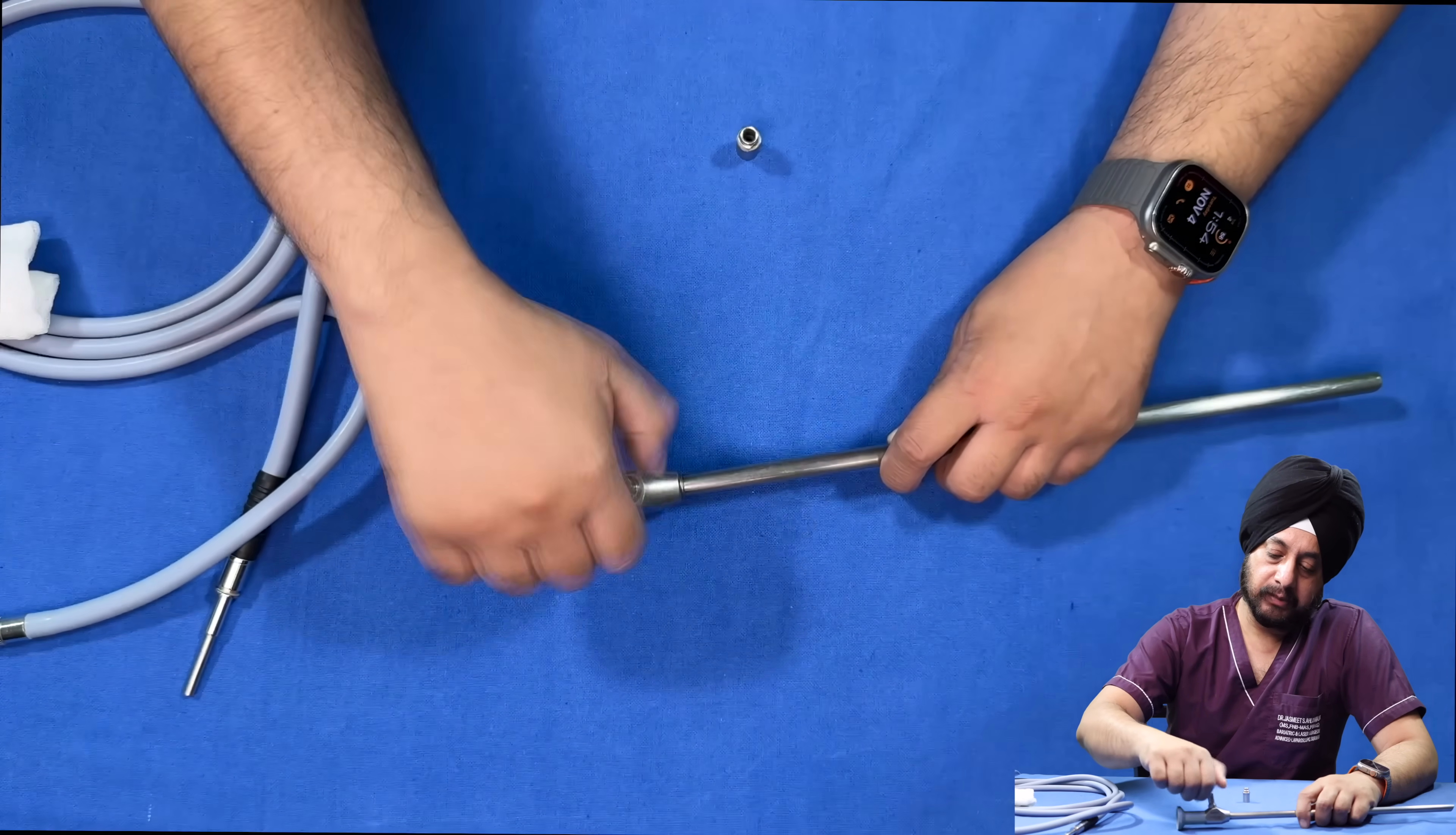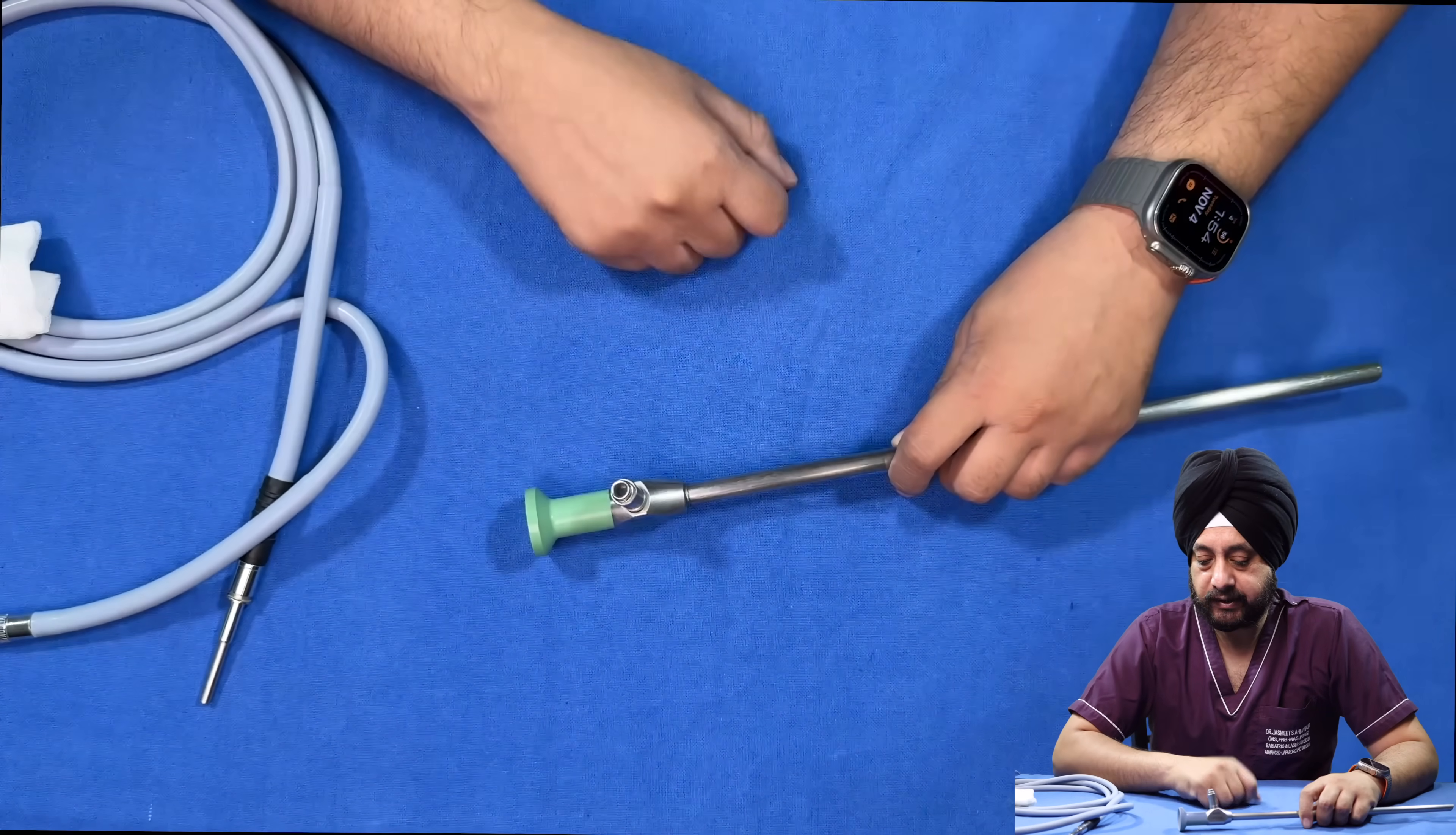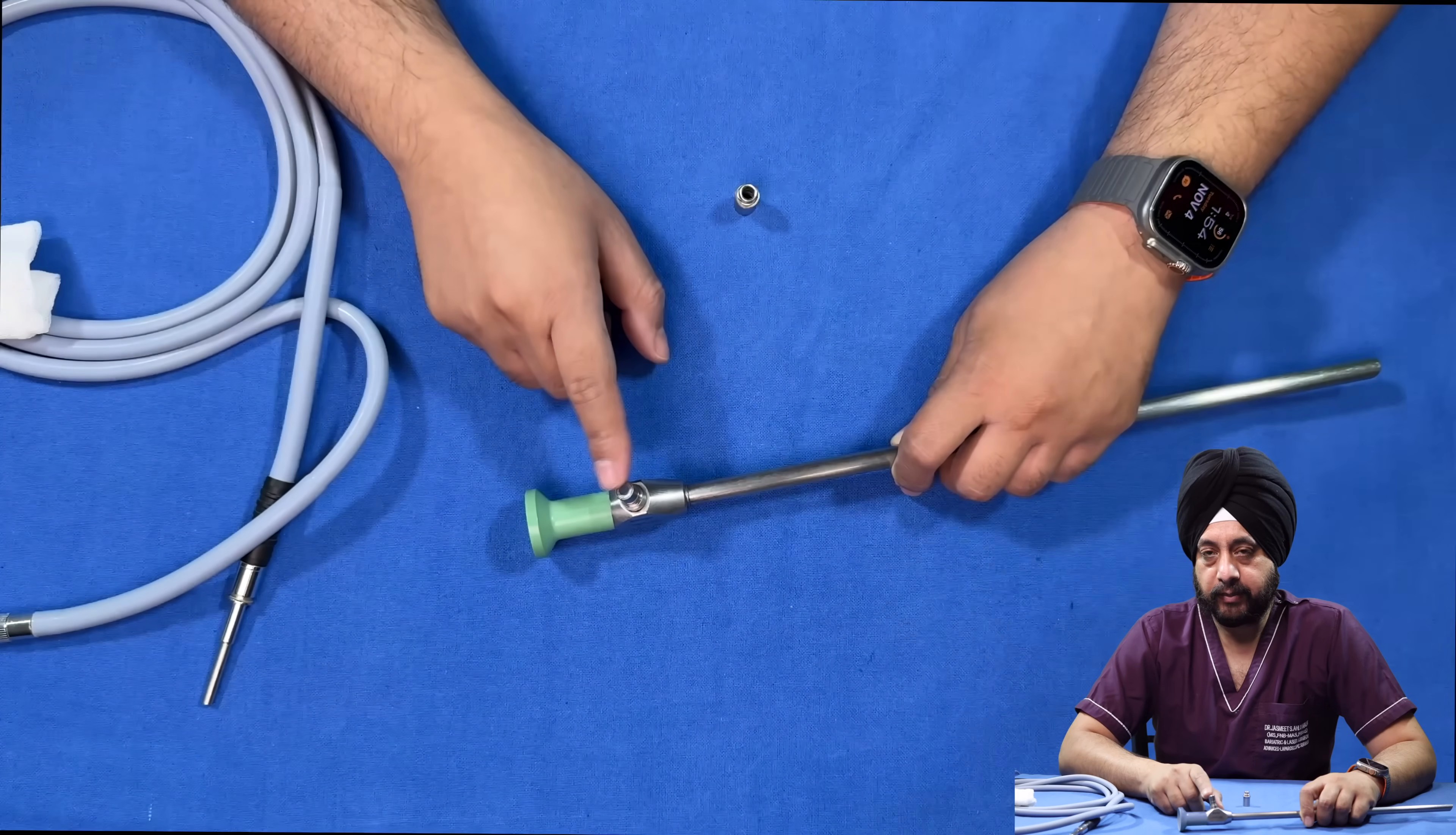The point to note is that the fiber optic end is quite deep. As you have more and more adapters over that, like the first one and the second one, it becomes almost impossible to clean the fiber optic end from outside. When cleaning the scope, make sure you remove the outer adapter, reach the end of the fiber optic, and clean it well with gauze.